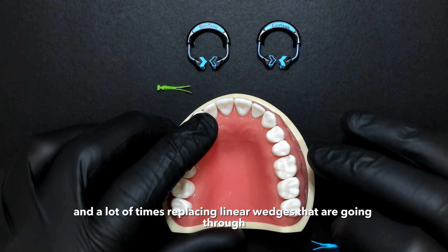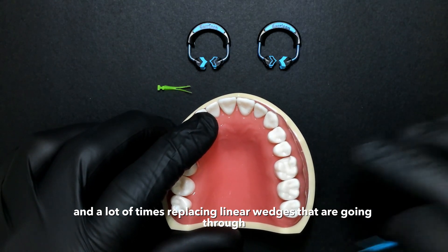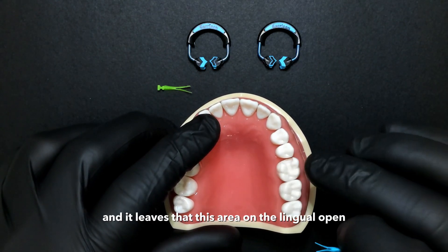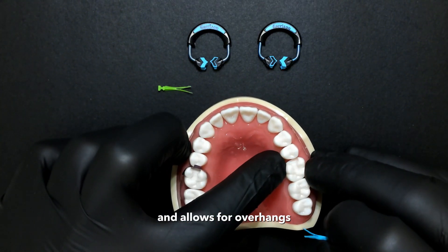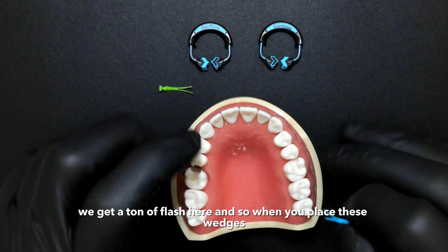There's a curve to this preparation, and a lot of times we're placing linear wedges that go through and leave this area on the lingual open, which allows for overhangs and we get a ton of flash here.